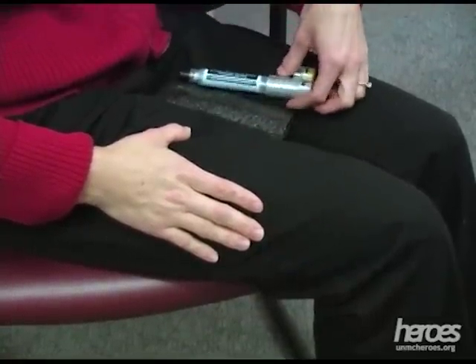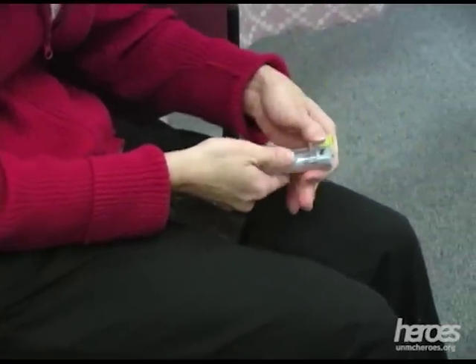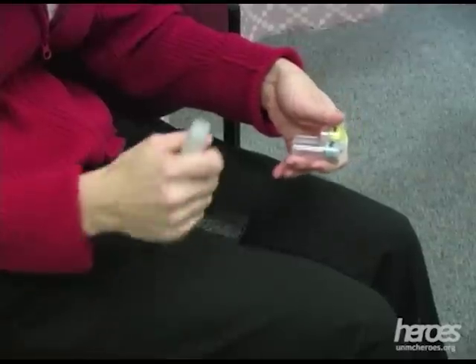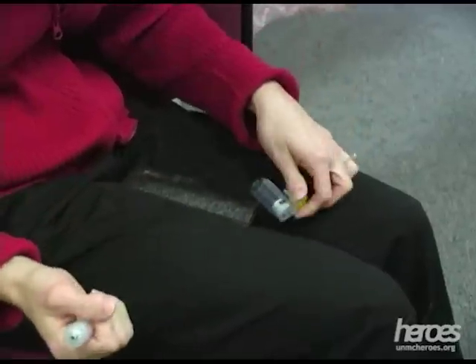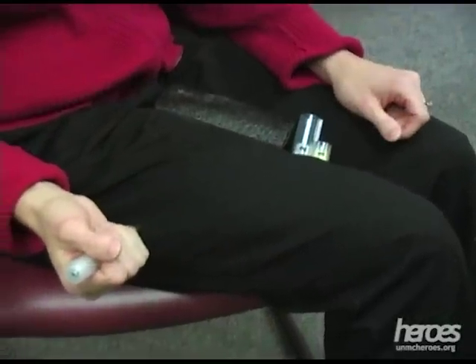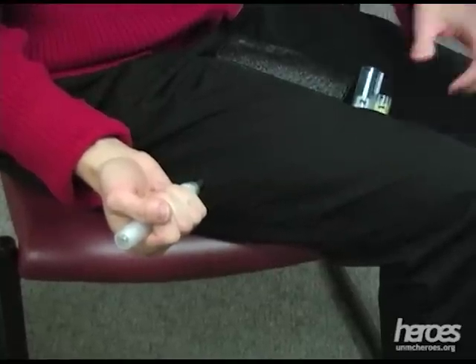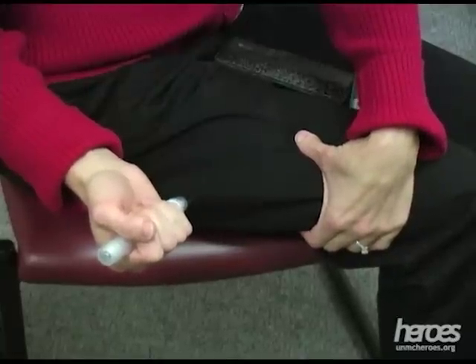Take the larger auto-injector from its holder, which is marked with a number 2. Firmly grasp it in your palm. Make sure that the gray safety cap is removed. Follow the same procedure as with the smaller auto-injector for administration, but use a slightly different area of the thigh. Remember that the outer thigh is a large area.